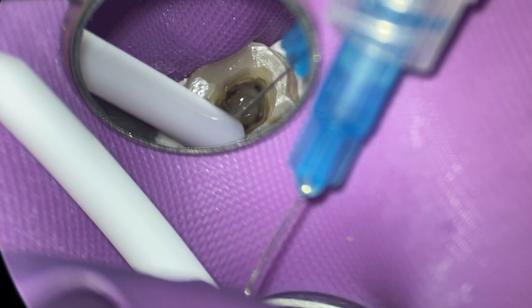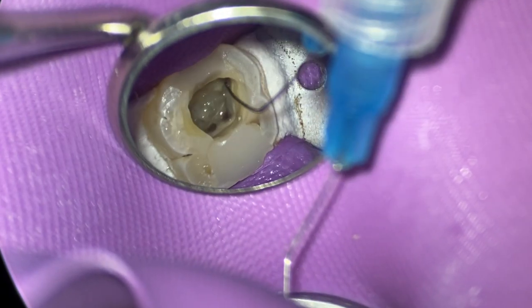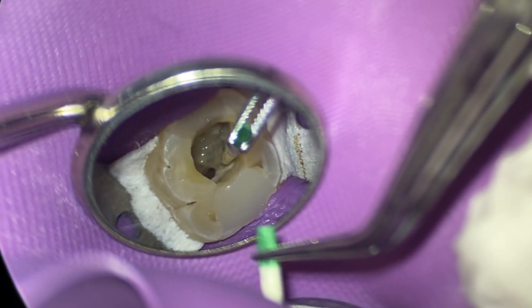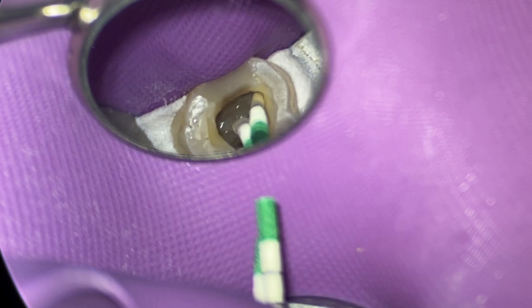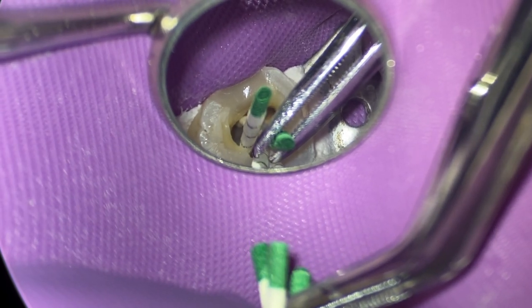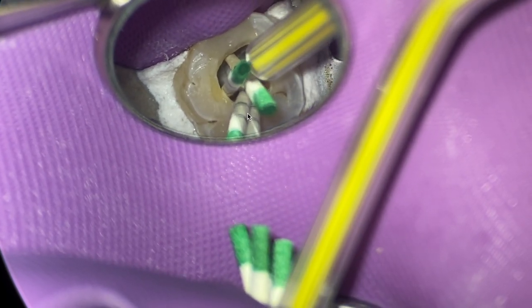Why is my gutta percha not going all the way down to my working length? Well, debris may have fallen down when I was irrigating and packed at the apical portion. I've had that happen. That's a fairly routine thing. So I'll make sure I'm not going to waste any time cleaning and drying with paper points until I've fitted all my gutta percha points. When I first got trained in residency, I remember talking about tugback and using irrigant to simulate the lubricity of the sealer to prevent, to make sure you have tugback. But I've gone away from tugback and I love it because my buddy Les really talked about, and Dominico Ricucci talks about an apical stop and I love it. I've used it ever since for a decade now.